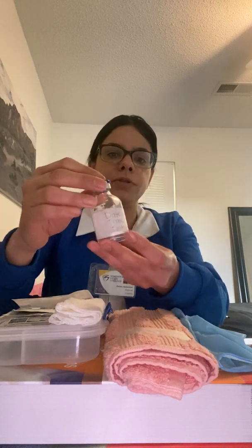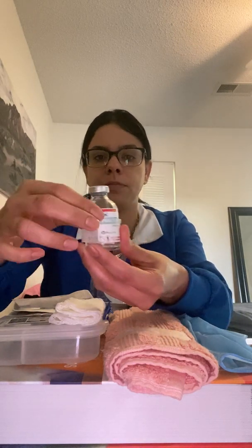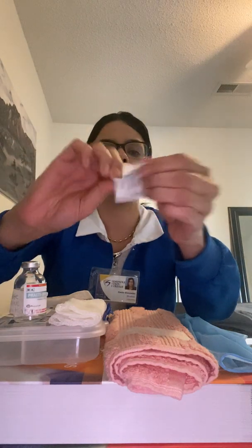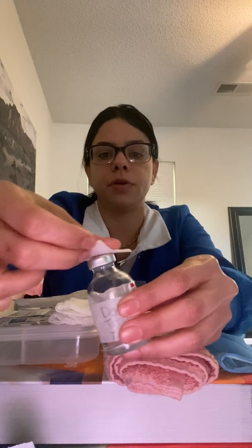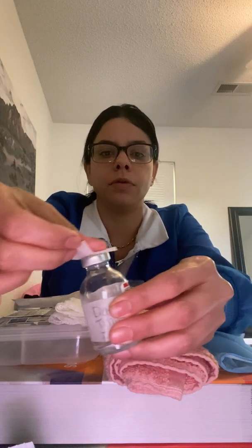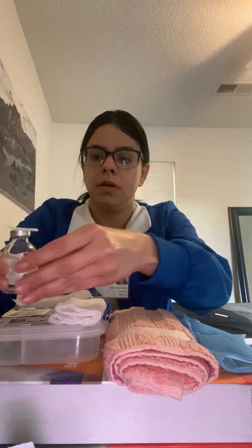And now, date, time, and initials, I am going to take the cap off, okay? And I'm going to take my alcohol pad. I'm going to open my alcohol pad, and I am going to clean that rubber part, making sure there are no microbes and stuff like that. And I'm just going to leave the alcohol pad on top as a reminder that I cleaned it.